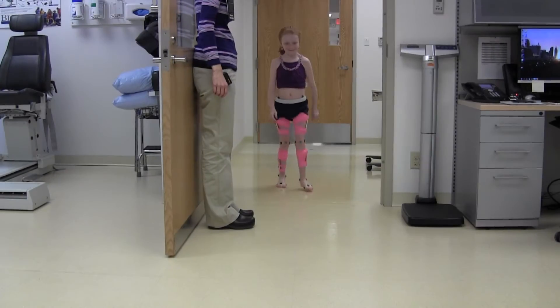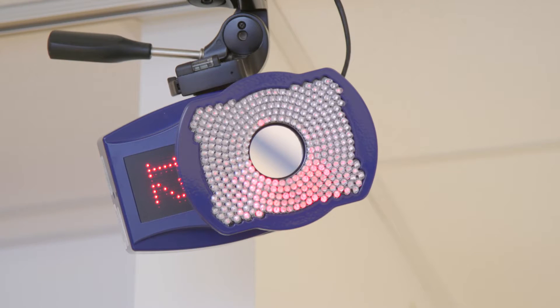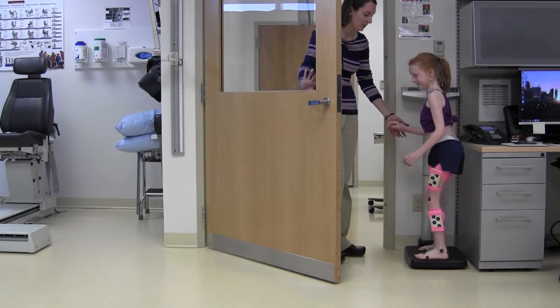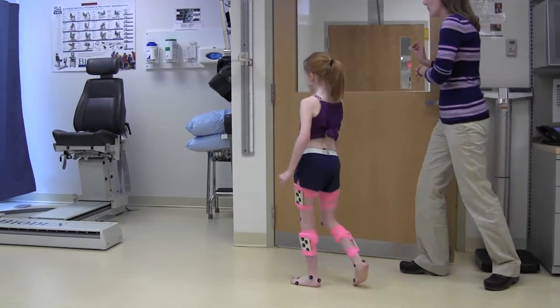Next, the PT will ask me to walk up a small ramp into another room where there are blue cameras with red lights all around the ceiling. The first thing I do in the new room is step on a scale to see how much I weigh. After this, I will stand against the wall and see how tall I am.